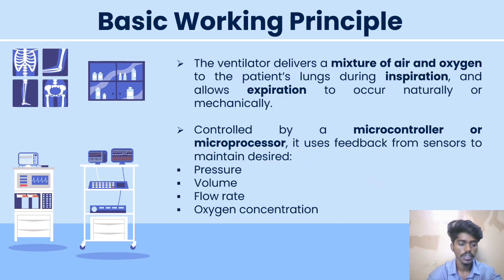transducers. Moving to the working principle, a ventilator works by giving oxygen-rich air during inspiration and allowing the lungs to empty during expiration. A microcontroller inside the ventilator adjusts parameters like pressure, volume, flow rate, and oxygen concentration.